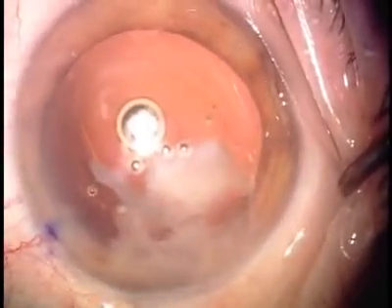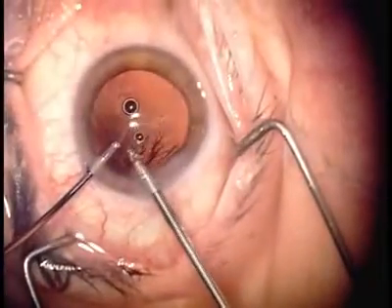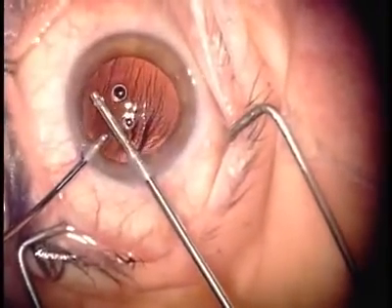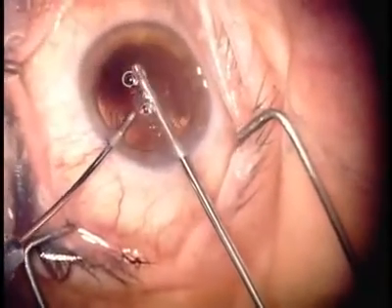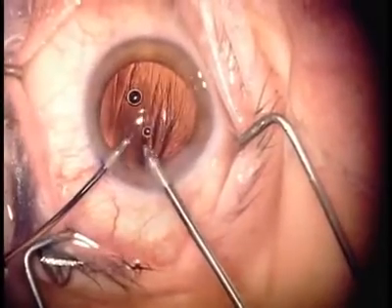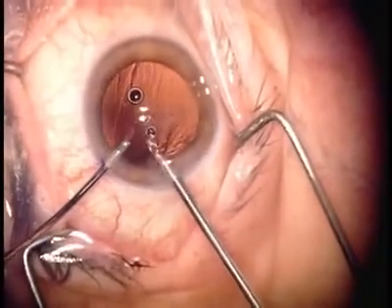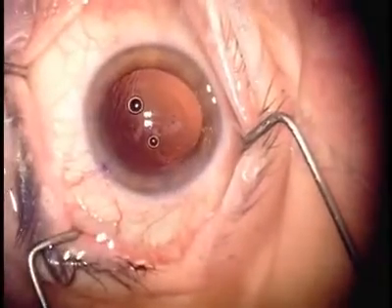You can see that the Kenalog is not going in very well because of the residual viscoelastic. And so here we're using the anterior vitrectomy instrument to remove some of the OVD. However, we don't have good control of the chamber because we're using the large incision that we made for the phaco needle for the small, thin anterior vitrectomy instrument. And as a result, fluid is pouring out around the sides.